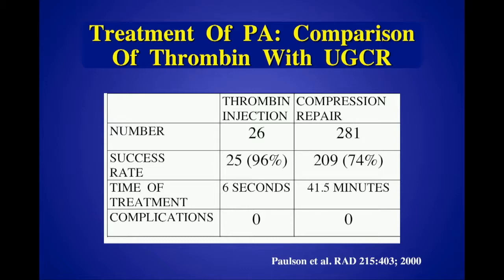The time of treatment is 6 seconds compared to 42 minutes, but that doesn't take into account the time of preparation for the thrombin repair, including the reconstitution of the thrombin. And in this series, he describes no complications.